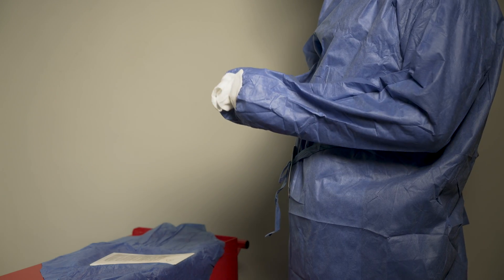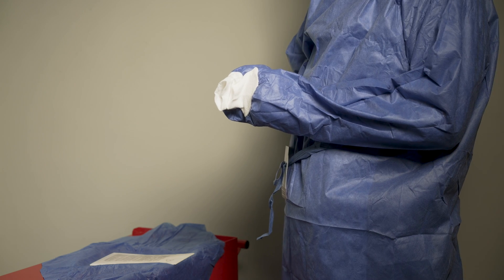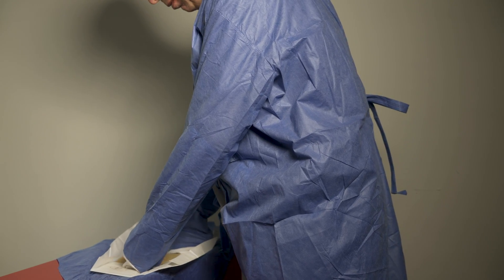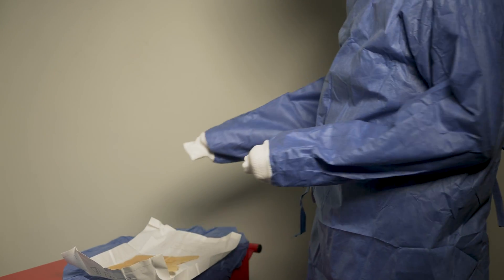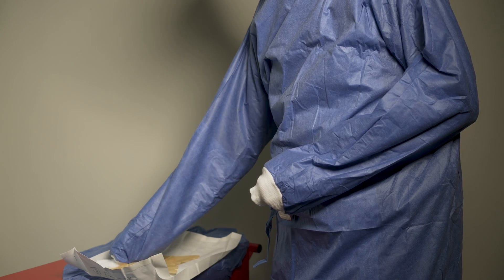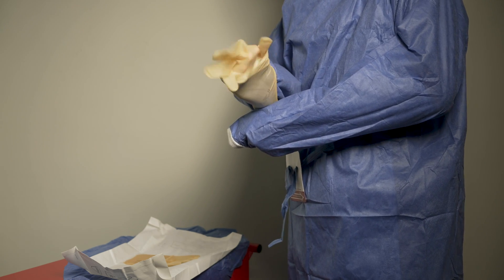We're now ready to wear the gloves in a closed fashion. My hands are kept inside the sleeves, slightly above waist level to avoid touching anything else. I go to the glove packet on a sterile surface, open it, fold it open, and bring it just slightly to the edge of the table so it stays open. I take my right hand — finger and thumb through the sleeve — onto the cuff of the right glove, which is labelled, lift it up, turn it over, then take finger and thumb from the other hand to hold the outside of the cuff and slide my hand into the glove.